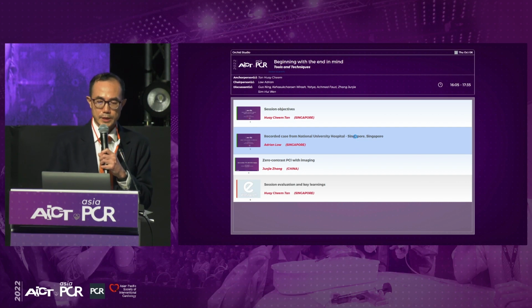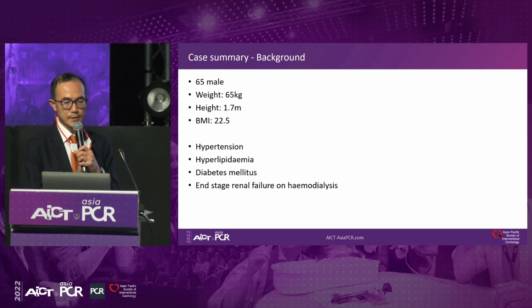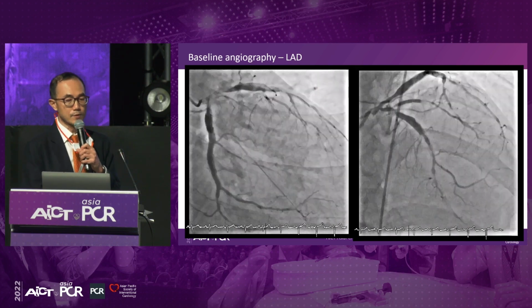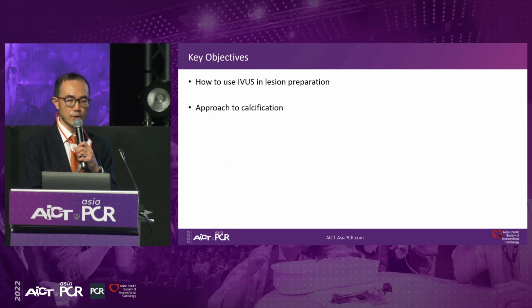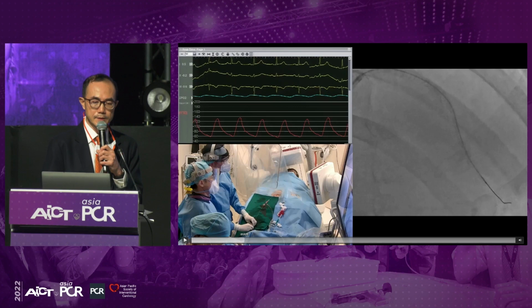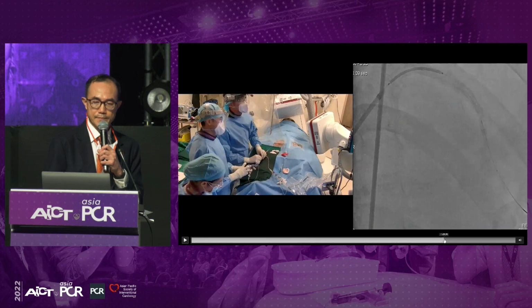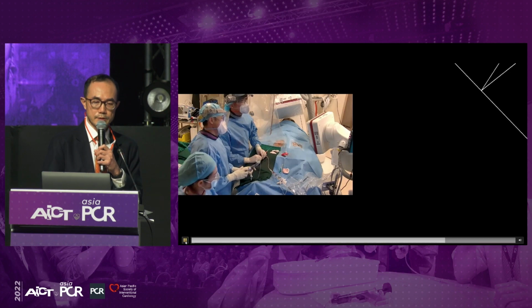For the proximal stent, we decided to use a Megatron, because one of the advantages of Megatron, as Hui Jim mentioned this morning, is that it is actually designed for use with the left main. Especially when you have a huge discordance between the end vessel and the left main, this is a good choice because of its expansion limit. So that's what we decided, because the left main clearly was a huge vessel, and this is the Megatron there.